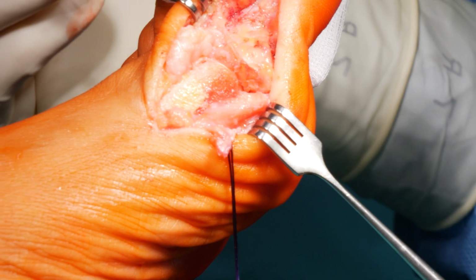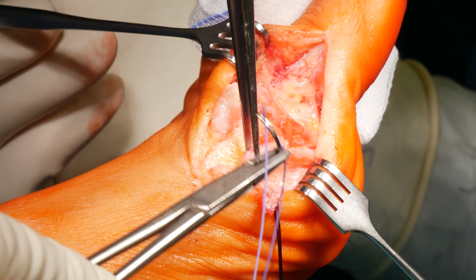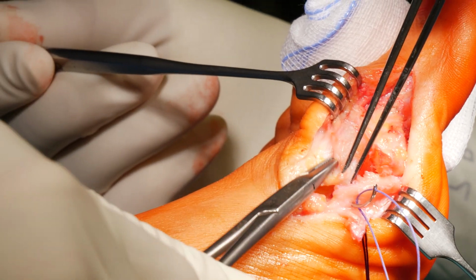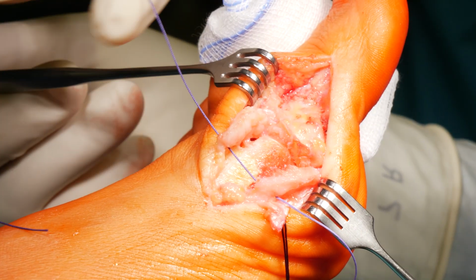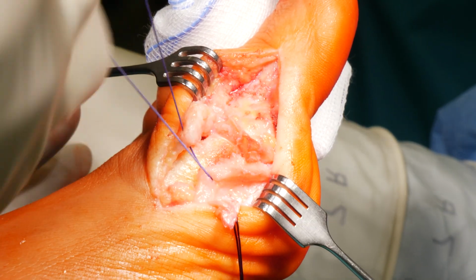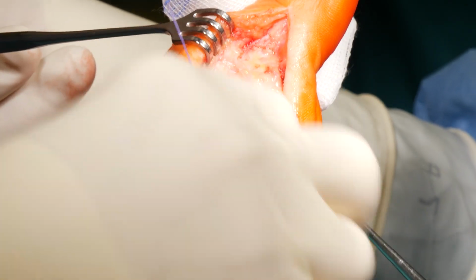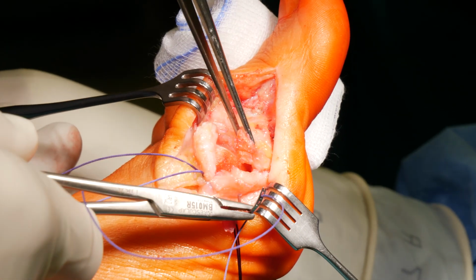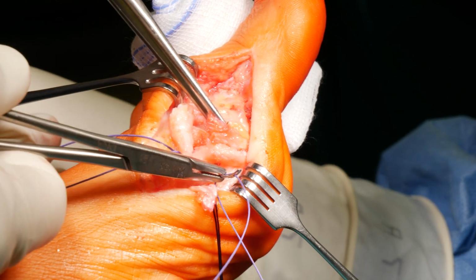Closure. The Y-shaped, incised capsule is sutured proximal, and the two flaps are sutured back, which allows for tightening of the excessive capsule. Care must be taken not to over-tighten the capsule, as this increases joint pressure.